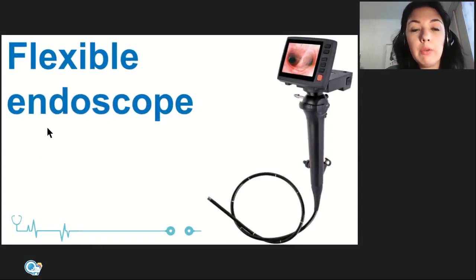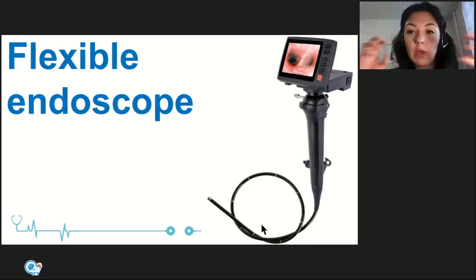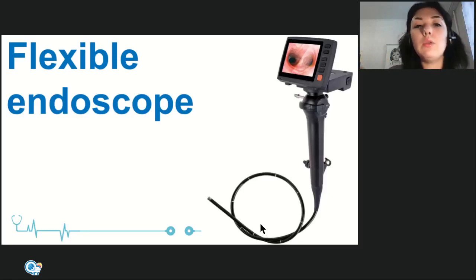So it's not compulsory that it will be rigid. Nowadays, flexible endoscopes are also very popular, and they are much more physiological. But in laparoscopy, we certainly prefer solid, rigid endoscopes. And in case of endoscopy, we will talk about it later, when we enter through the natural orifices, certainly flexible endoscopes are preferable.